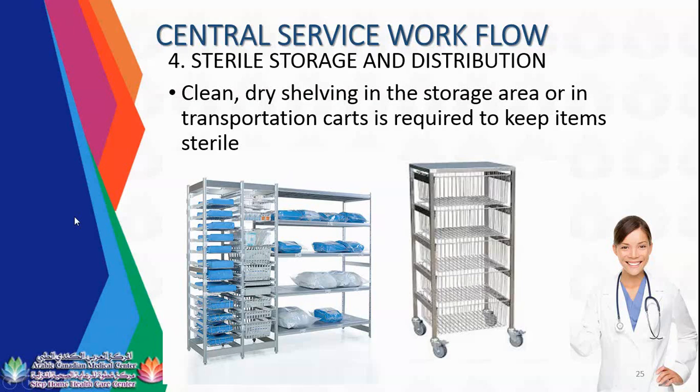Once you place your instruments, you cannot overstack or place one instrument on top of another. As you can see in the picture, one instrument is placed on one area. The reason you cannot overstack the instruments is that the lower pouch might get damaged. Also, in the picture, the instrument set has a plastic cover. This is a dust cover, actually. It will protect your sterile instruments from contact with any dust or contaminants, especially when you are transporting the instruments.